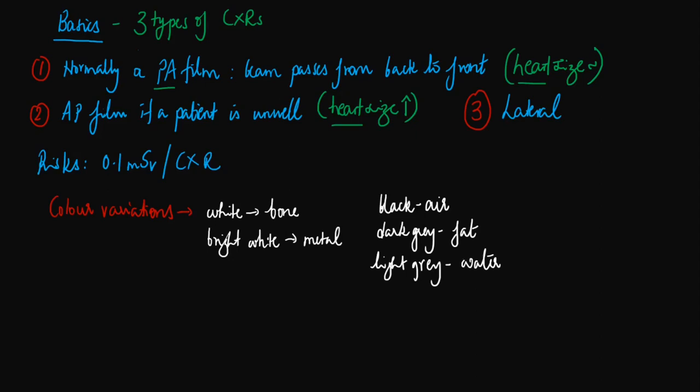The amount of ionizing radiation per single X-ray is 0.1 millisieverts. This is considered negligible for causing cancer.